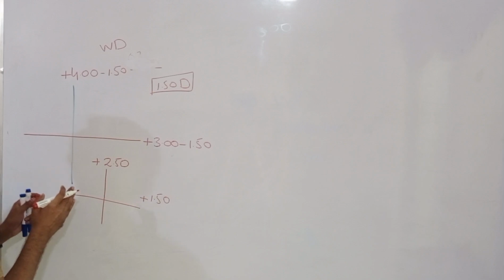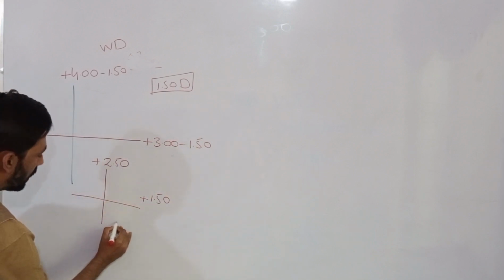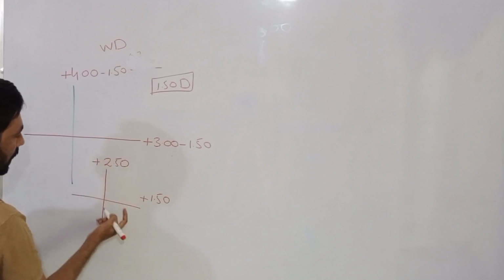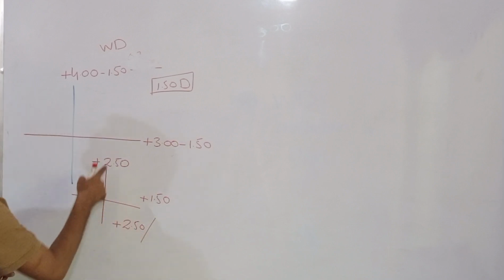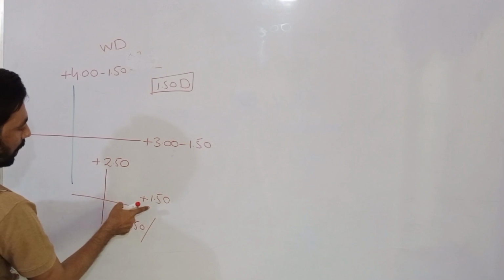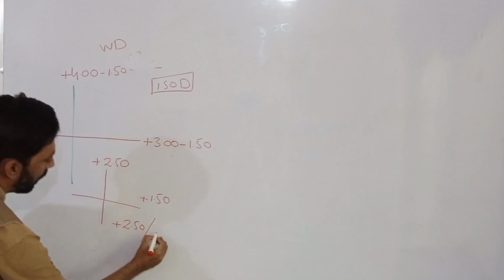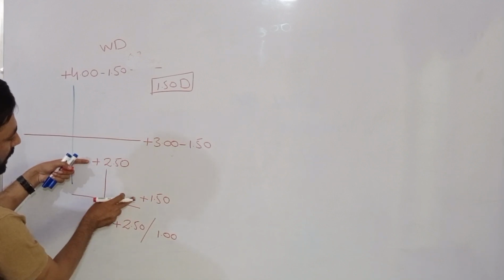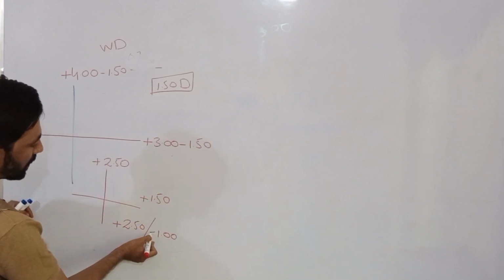So in this case, I repeat, the patient is looking at distance. The accommodation is at rest, right? We can consider this neutral point as our spherical correction. So +2.5 is our spherical correction. To find the cylinder, we have to move from +2.5 to +1.5, right? So the gap between both of these values is 1. What about the sign of the cylinder? We are moving from bigger plus to lesser plus, so we are moving towards the minus side. So the sign of the cylinder would be minus.